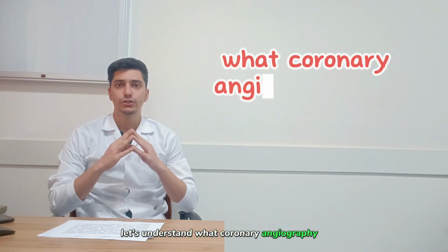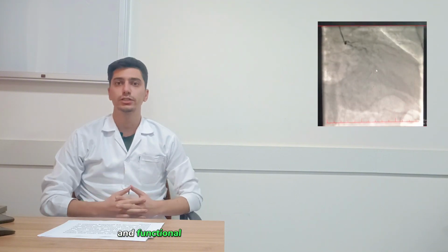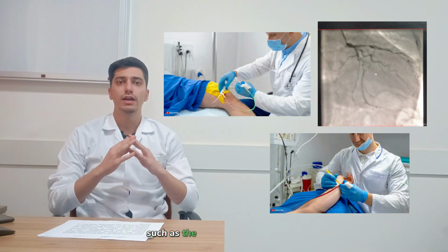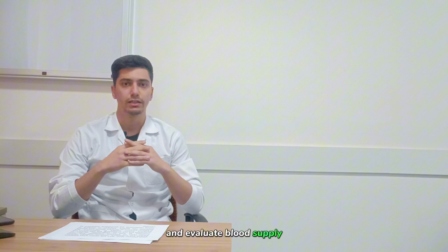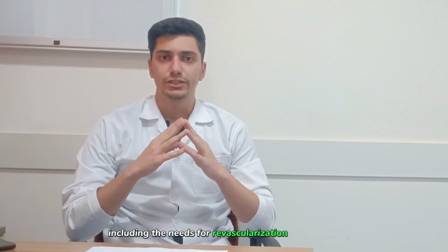First things first, let's understand what coronary angiography is. It's a cardiac catheterization procedure used to diagnose structural and functional disorders in the coronary arteries. By inserting radiopaque catheters into a large artery, such as the femoral or radial artery, doctors can visualize the coronary arteries and evaluate blood supply. This information helps guide treatment decisions, including the need for revascularization procedures like PCI or CABG.